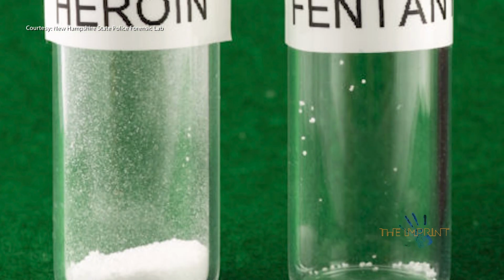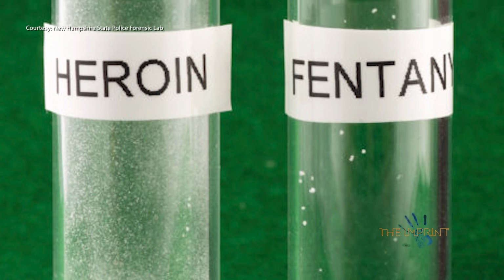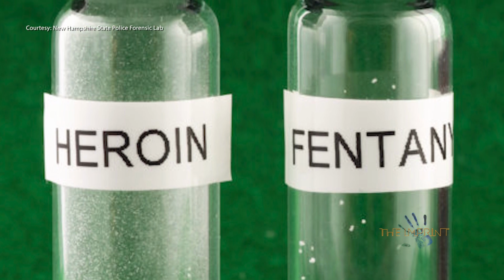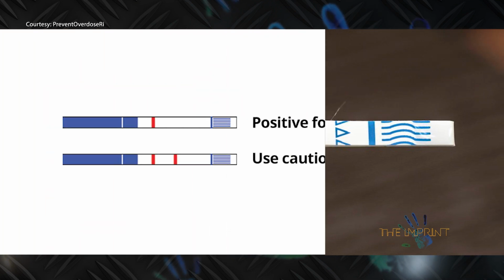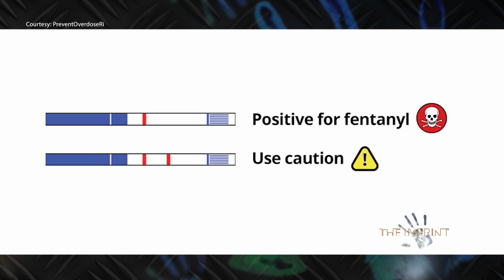So in the case of fentanyl, it started off having uses in the medical field, but now it's made its way into illicit narcotic use because it's not being used by a physician. Fentanyl test strips are used to determine whether or not a narcotic or other substance has trace amounts of fentanyl in it. They are truly presumptive tests. They cannot identify every analog of fentanyl. The fact that it may not be able to detect every analog of fentanyl may give you a false negative.